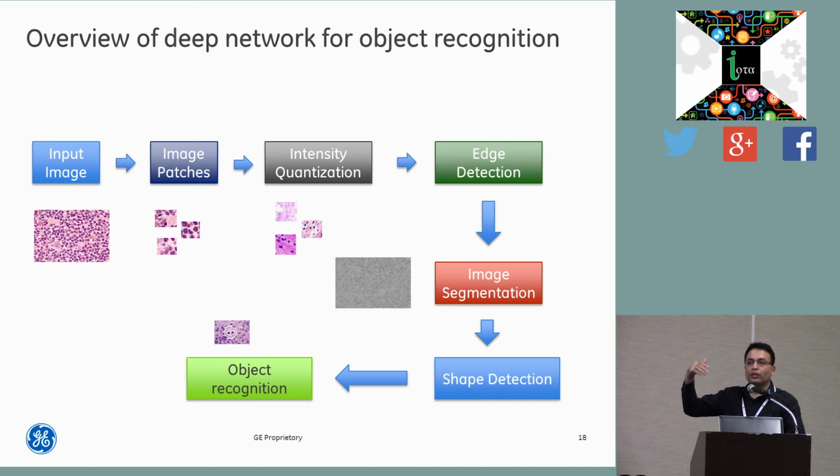Internally, they might represent more than one step. In many cases, they actually have multiple steps. But the idea is that you normalize the image, then the network learns how to detect individual edges, finally understands shapes out of it, and eventually identifies an object like a Reed-Sternberg cell or a lacunar cell, or just normal cells where it would say, hey, some of these cells are non-cancerous.